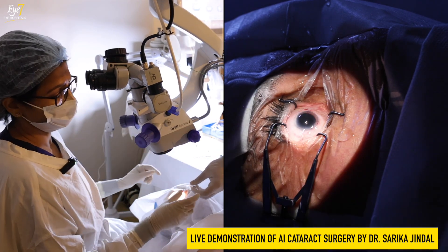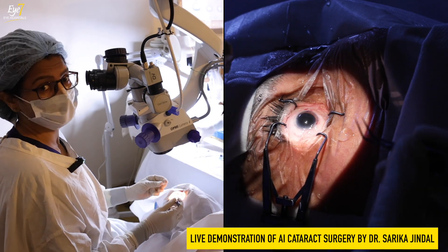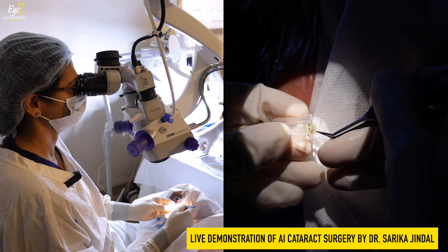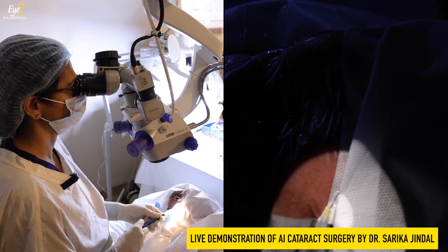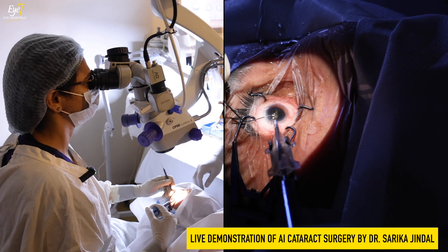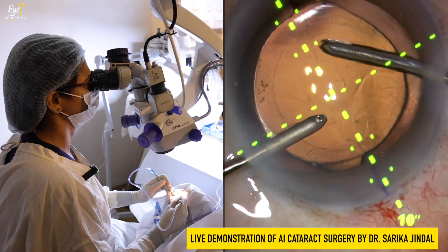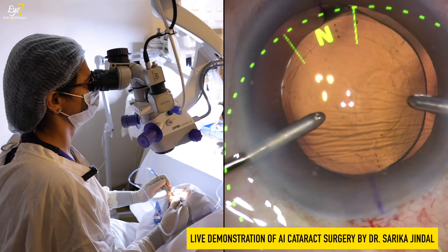We had varion's help with the axis marked, and now we will implant the lens on the correct axis. The toric IQ lens is implanted at a particular axis. This axis is determined at the beginning of surgery with varion machine guidance. Varion is a machine which gives you real-time axis marking during the surgery.